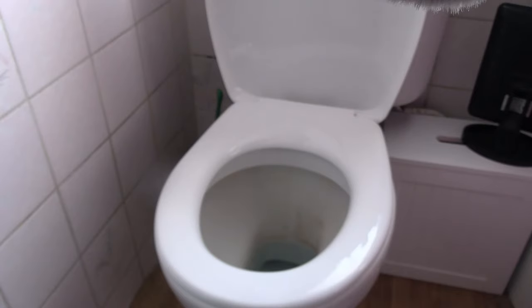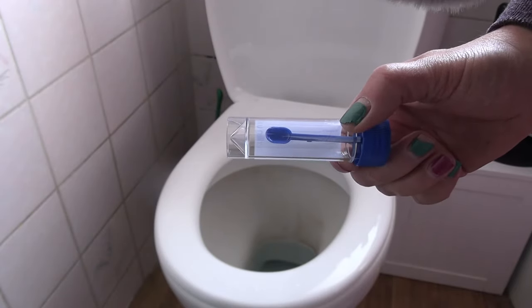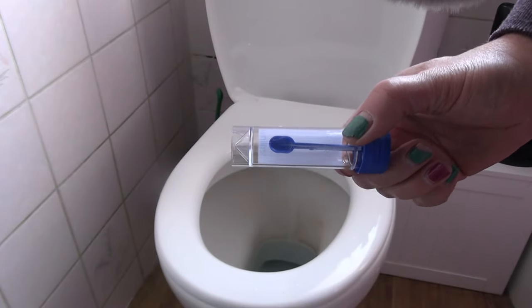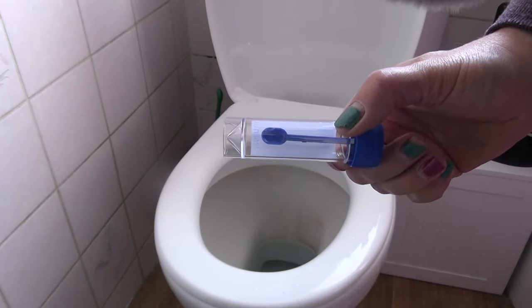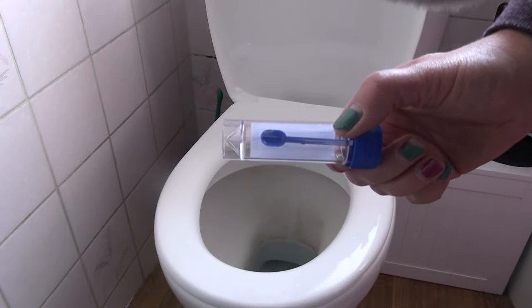Hi, you've been given one of these by your doctor. Yes, it's time to do a poop sample. But no one tells you how to do it. I will.